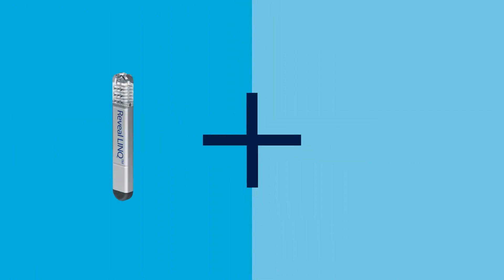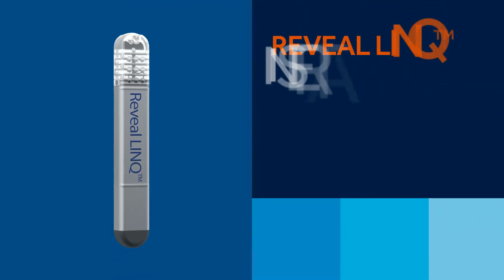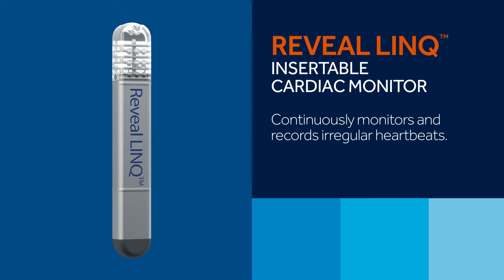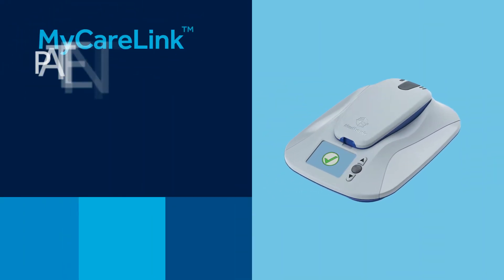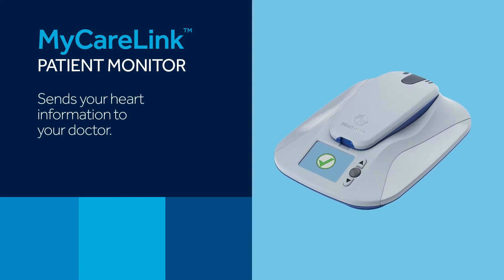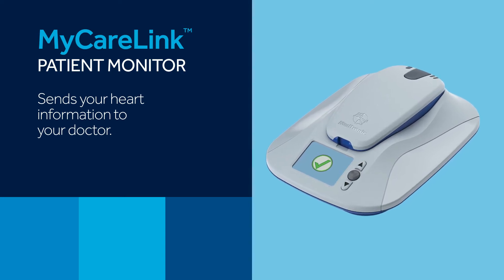Now, let's review the components of the system and how they work together. The system has two primary components needed to capture heart information and send it to your doctor. The Reveal Link insertable cardiac monitor, or ICM, continuously monitors and records irregular heartbeats. And the MyCare Link patient monitor, which is a bedside unit that collects data from the Reveal Link ICM and sends it to a secure location where your doctor can view it.